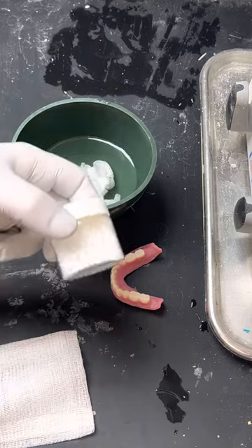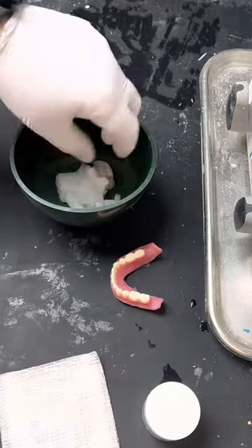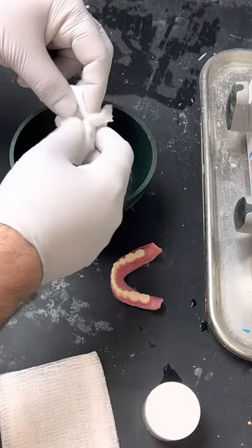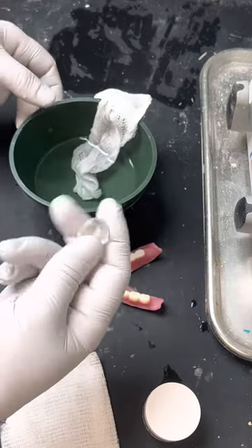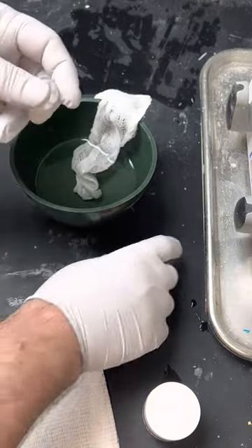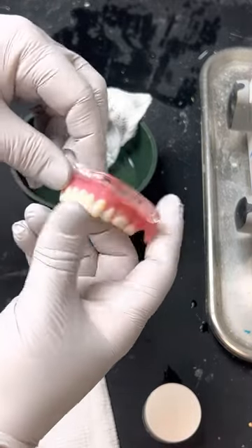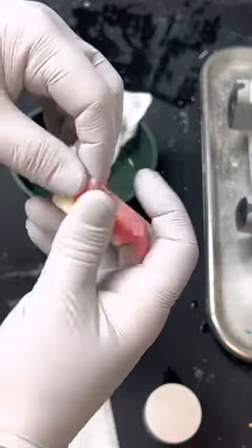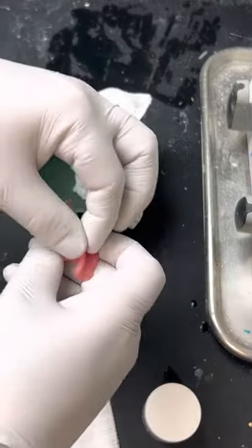So I tried the same thing with the thermoplastic beads — just wrapping some into this 4x4 and putting it in hot water. And as you can see right here, it melts it perfectly and it doesn't stick to the gauze. You can go ahead and border mold with this however you need to. In this case, I'm going to just add a little bit right here, just like this.